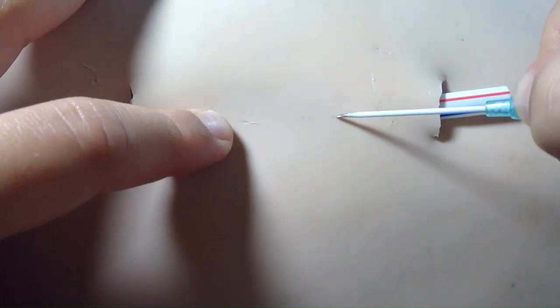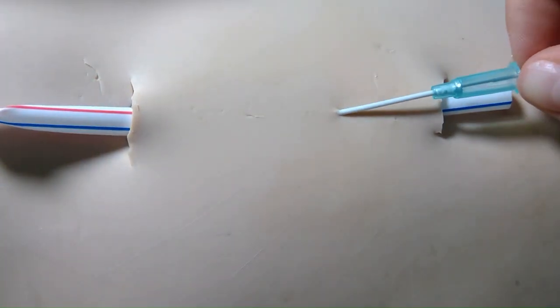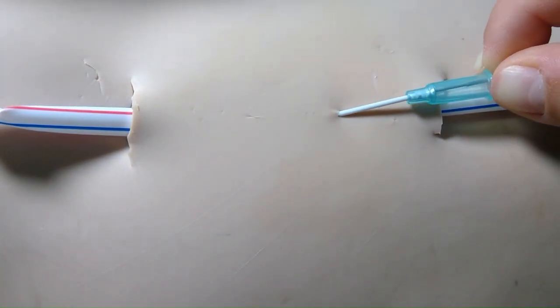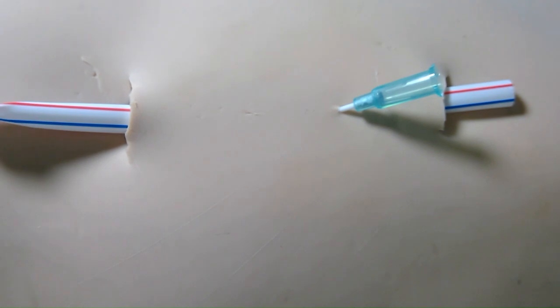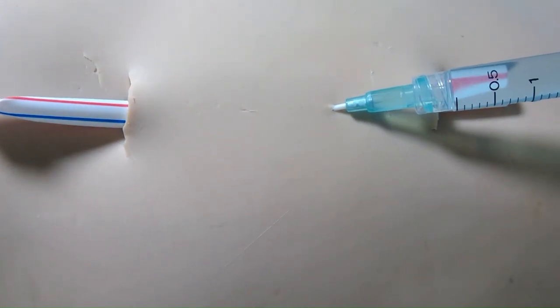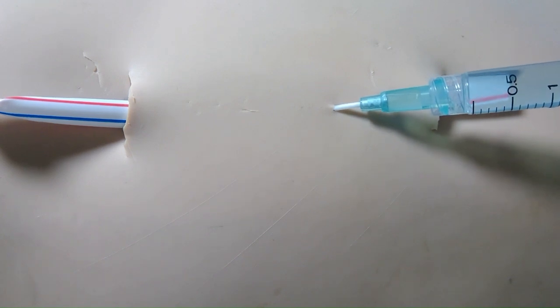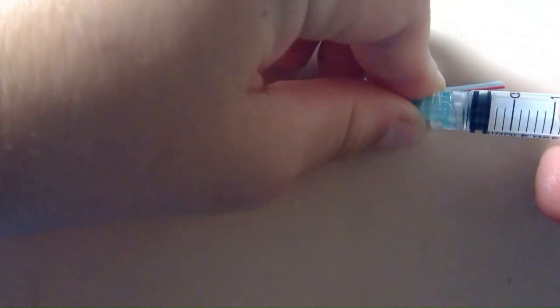We're gonna stick right here and feel for a slight give. Once we've felt that slight give, I'm gonna slowly take out the needle and introduce the catheter further in — there we go. Then you would flush it with saline, but I'm gonna use this light blue liquid so you can see it come through. We're gonna attach it to the IV catheter and flush the IV.